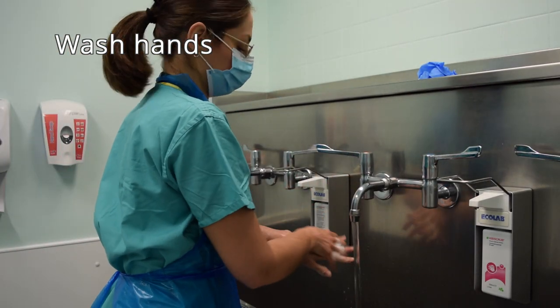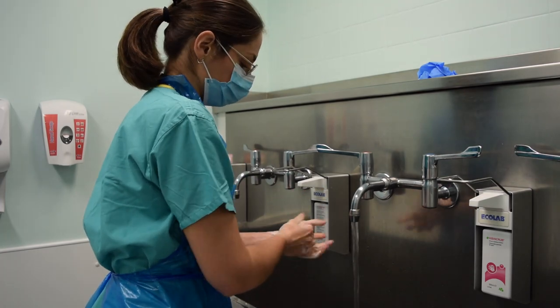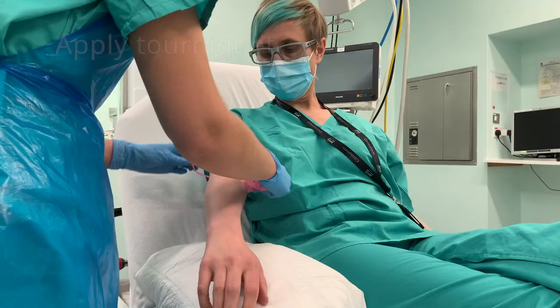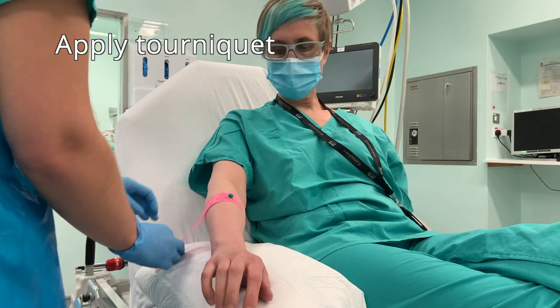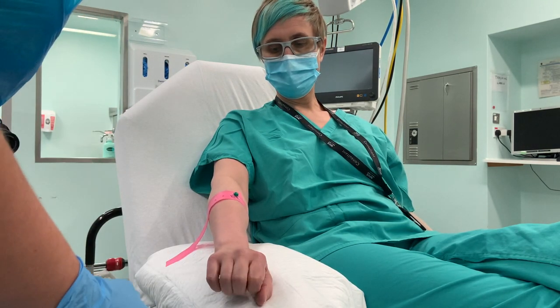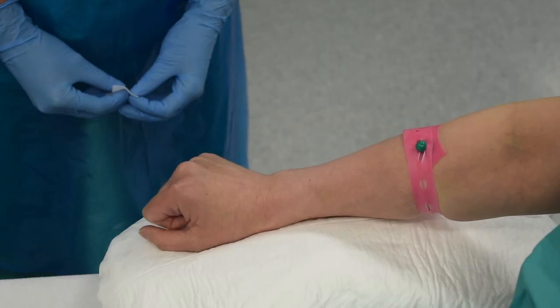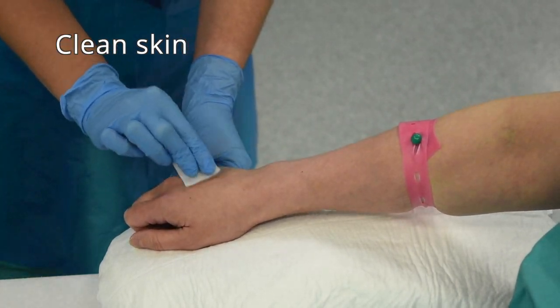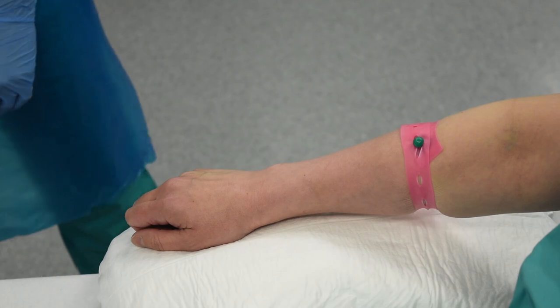Start by washing your hands thoroughly according to your local trust policy before contacting the patient, and make sure you're wearing the appropriate PPE of an apron and gloves. Apply a tourniquet and ask the patient to pump their fist up and down a few times to encourage blood flow distally and enlarge the veins so you can identify an appropriate target. Clean the skin well with a criss-cross pattern for 20 to 30 seconds to ensure it is completely sterile, then prepare your cannulation equipment.